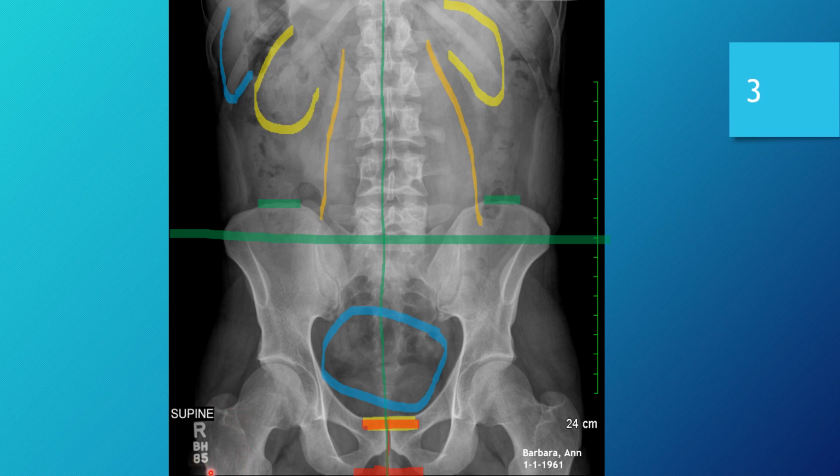The radiologist does appreciate that. And we have our anatomical marker with the side indicator as well as the tech initials. So good there. We have our patient name and birthday over here. So all we need is a medical record number, and we would have complete reference information for this image.